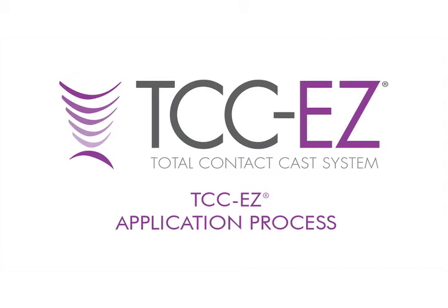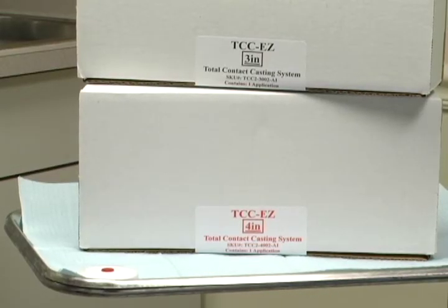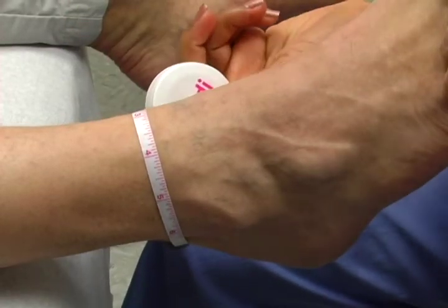The following is a demonstration of the TCC EZ Total Contact Cast System application process. The TCC EZ cast socks come in two sizes, a 3-inch diameter cast and a 4-inch diameter cast. If you are unsure of which size to use, ankle and calf measurements can assist with making a decision.